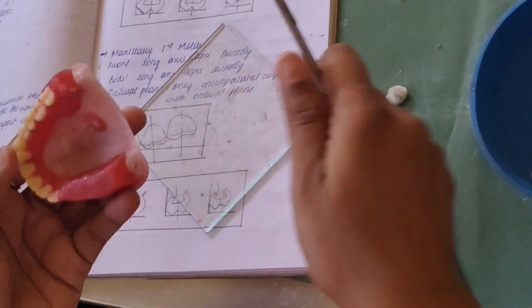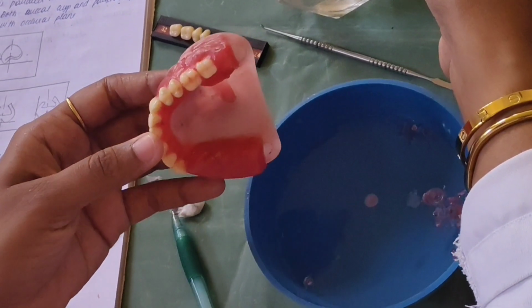Okay, I will seal this and remove the entire relation. Now it is very clear.